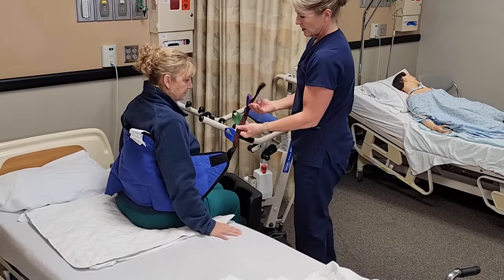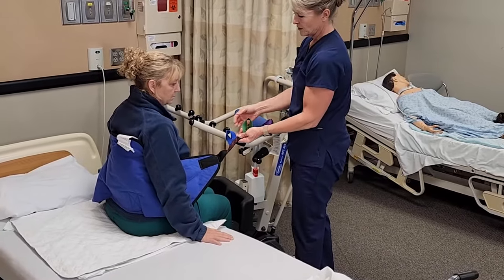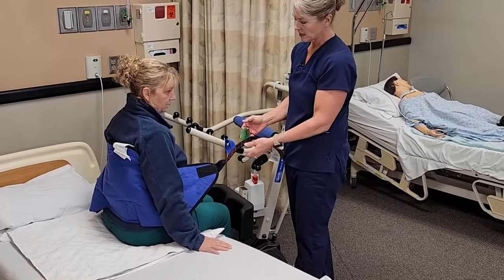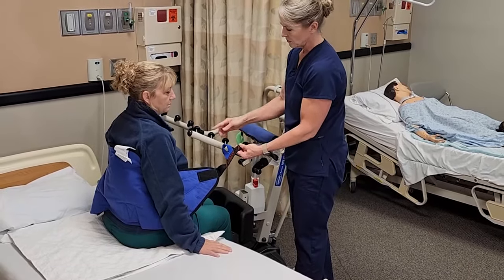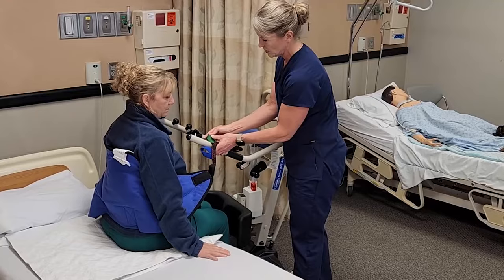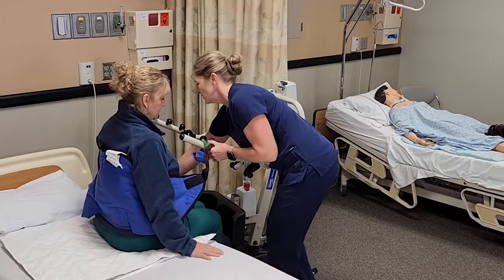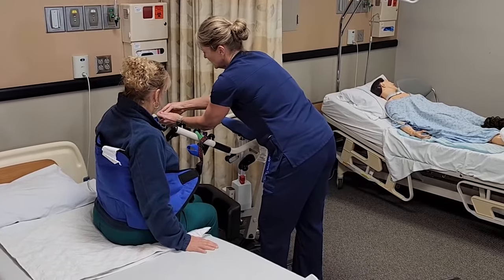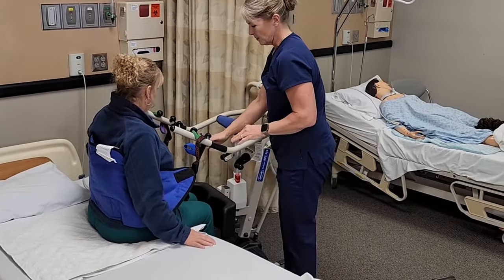There are four different colors here that are going to be further or closer to her body. You want to look in the care plan and see what you should use and which part on the machine to use. Make sure that you use the same color and the same knob on both sides — I have green in the middle on both sides.